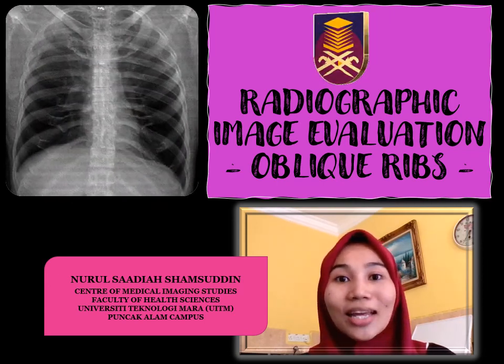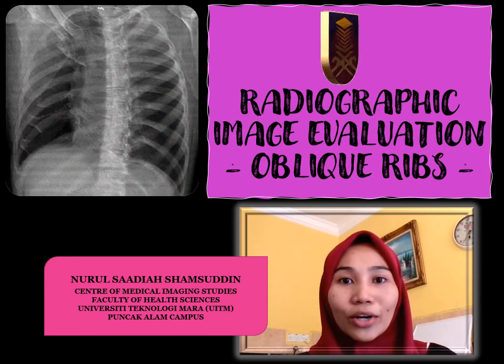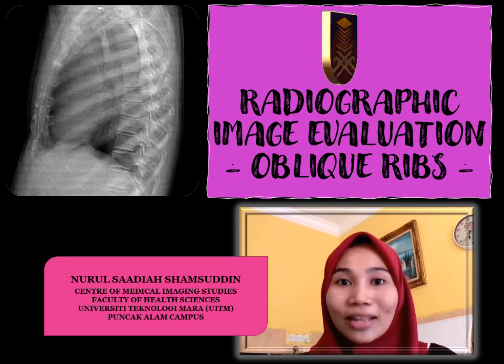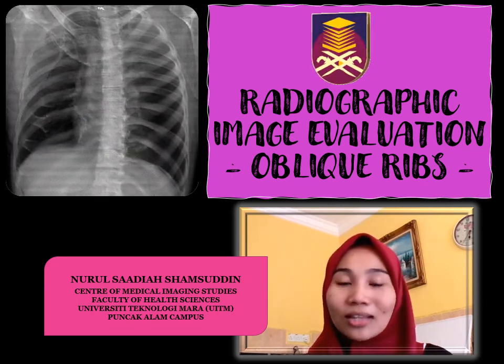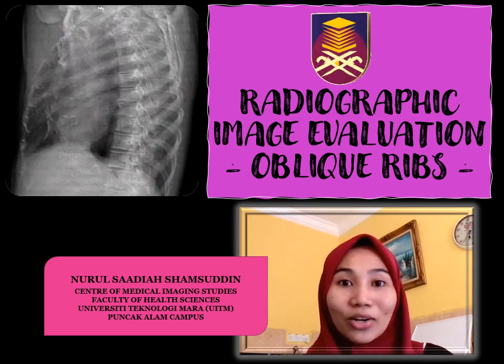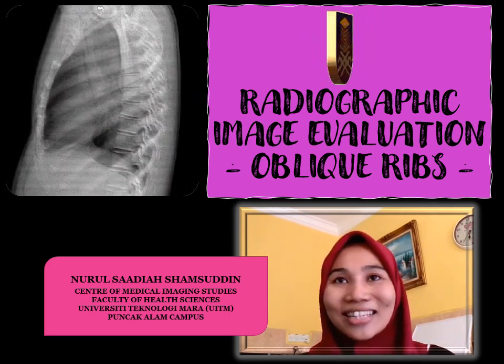Today, I'm going to talk about radiographic image evaluation of ribs in oblique position. If you find this video beneficial, then you may share this video as a learning material for evaluation of oblique rib radiograph. So yeah, let's get started.